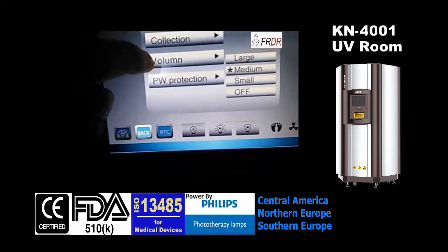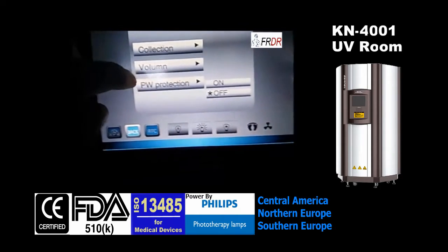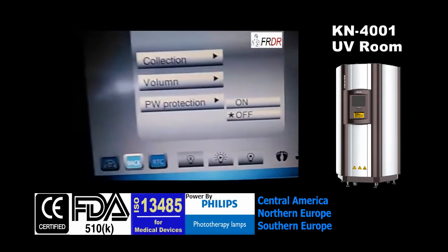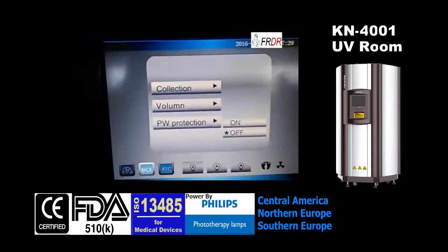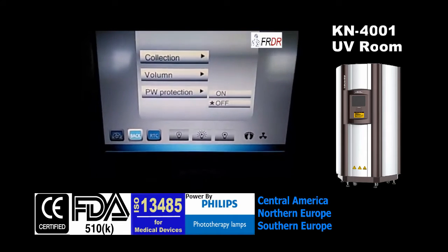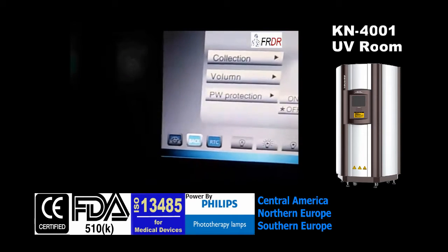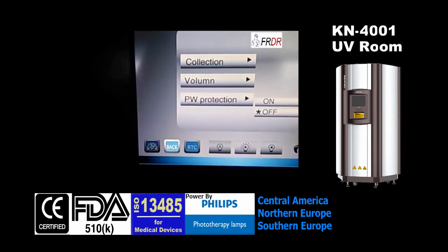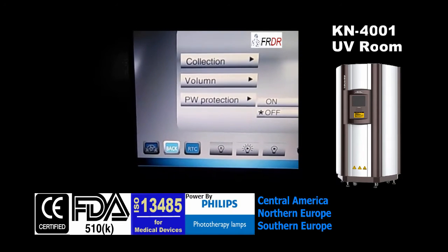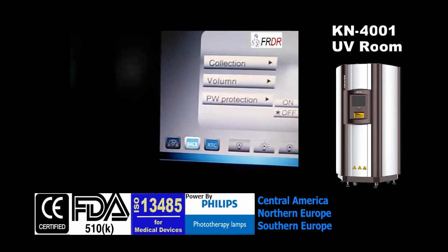This is to adjust the volume, and this is password protection. When we choose it on, every time we start this machine the first screen we see is the password screen — we have to input the password to get into normal mode and start the operation.